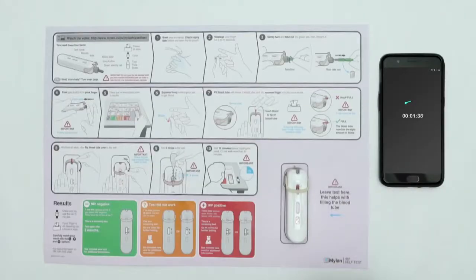Set your timer and wait 15 minutes before reading the result. Reading the result before 15 minutes could give you a false result. However, do not wait longer than 20 minutes.